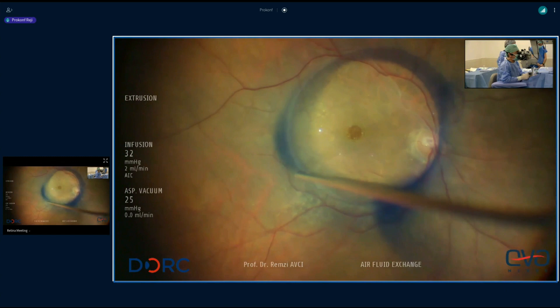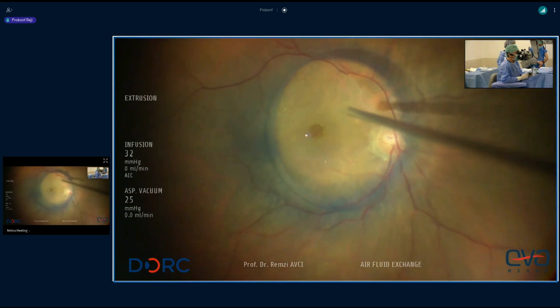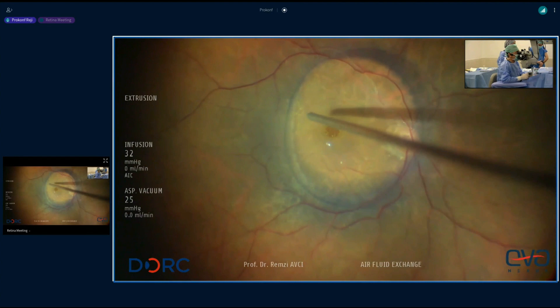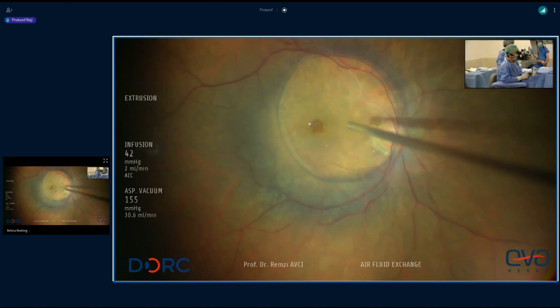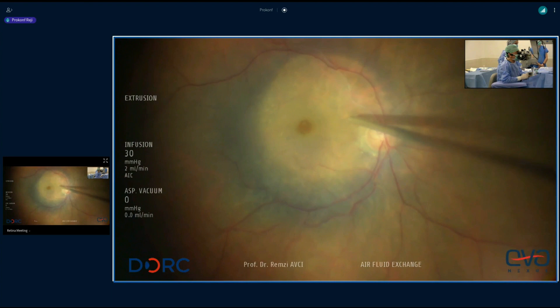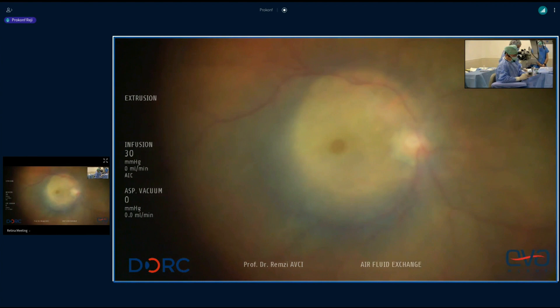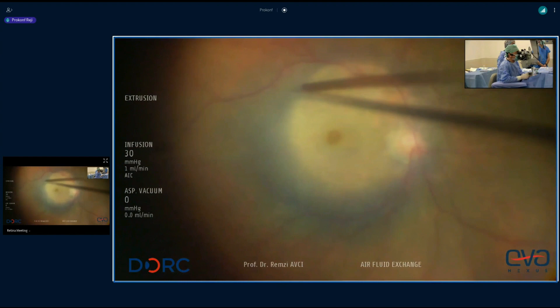I remove the dye and during this whole procedure infusion is open, and there's no big turbulence — the dye is not spread all over the vitreous cavity. Now I remove the PFO completely, because we should pay attention to remove all PFO from the macular area. As you see, the temporal part is perfectly stained and the outer part is not.